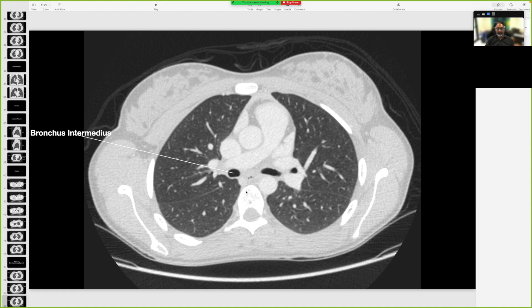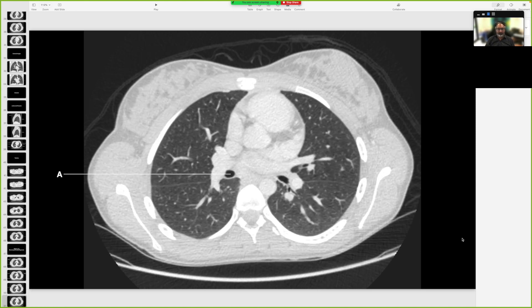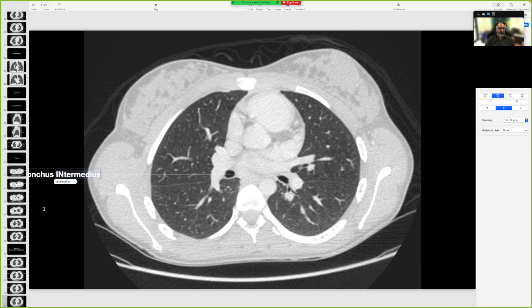That is the bronchus intermedius. Now you know bronchus intermedius — can you see these vessels? That's the SVC, that's the pulmonary trunk, and that's the right pulmonary artery. So you understand the heart; the lungs will be clear by the end of the session too. That is still bronchus intermedius — I just took it down one more level.